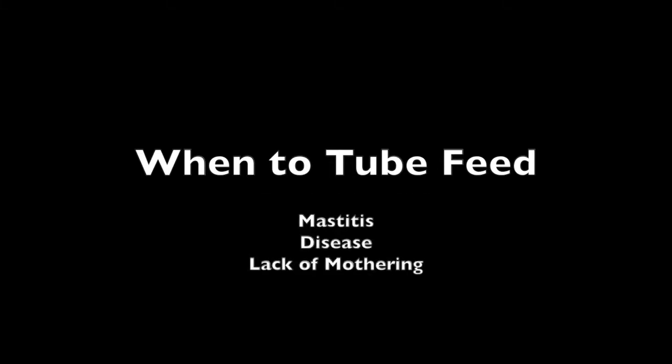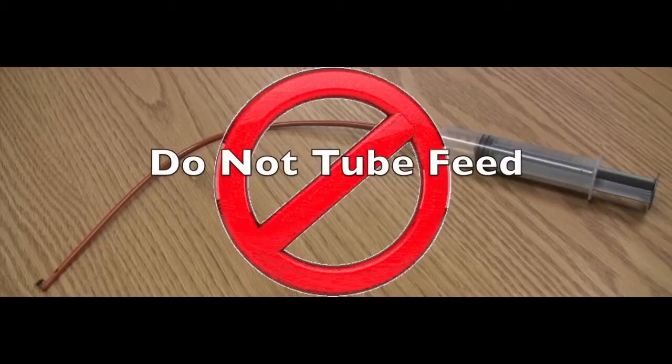Lambs that are too weak to nurse are good candidates, as well as lambs with mothers that are lacking milk in situations such as mastitis, disease, or plain lack of mothering. Tube feeding can also be used to hydrate lambs with diarrhea by adding electrolytes. Do not tube feed a hypothermic lamb until its body temperature is raised to a normal level.